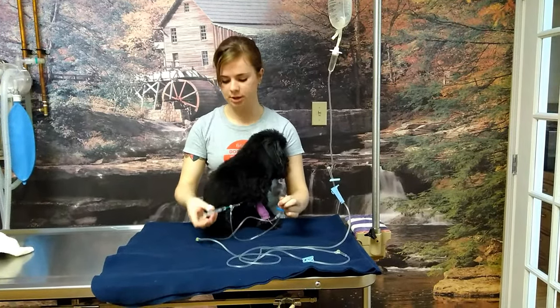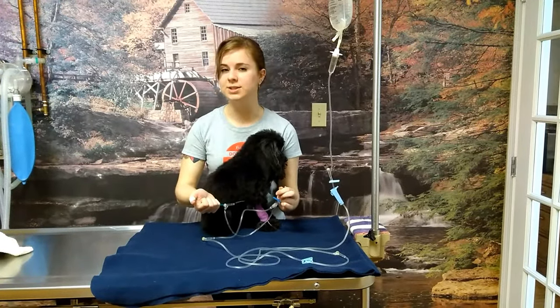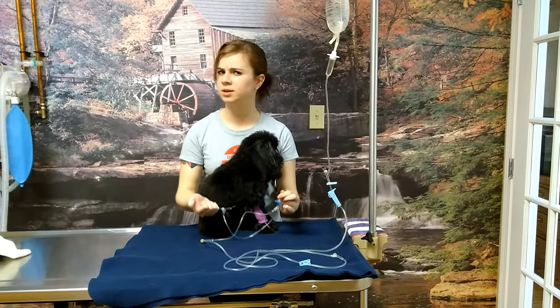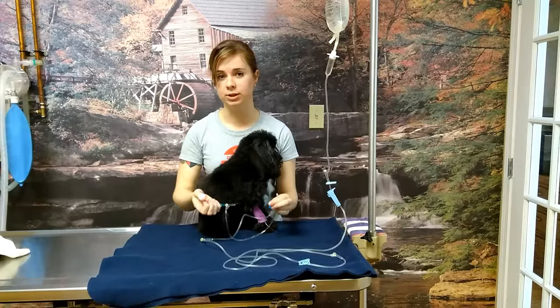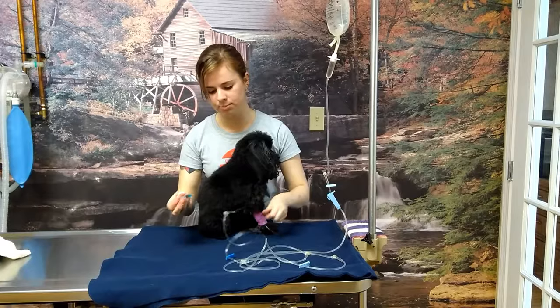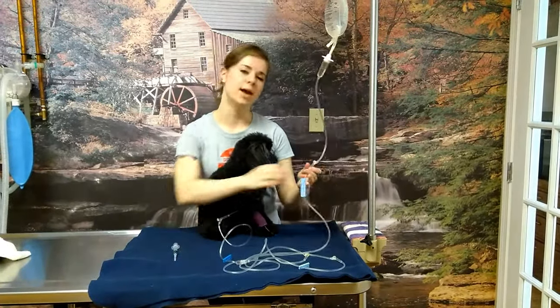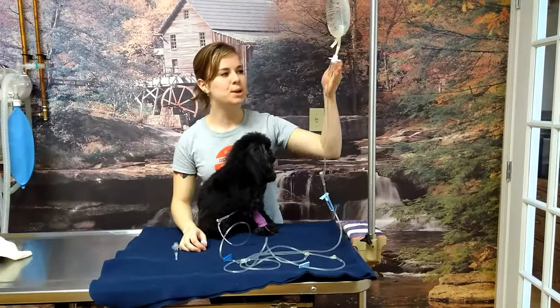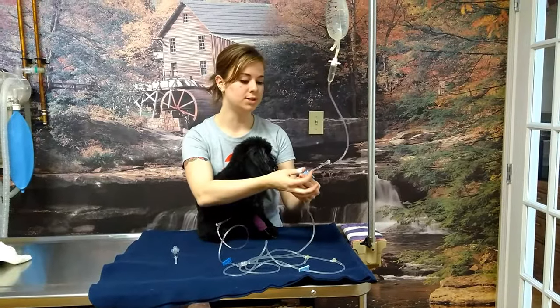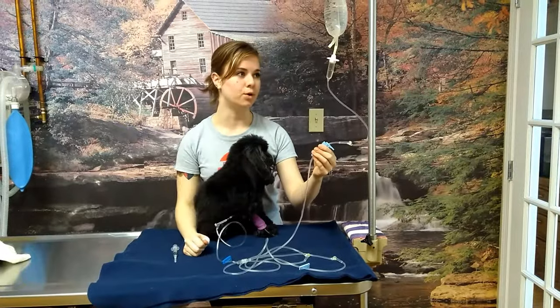Pinch closer to the bag than to your pet, and slowly pump in the fluid in short but strong bursts — that will hopefully push the clot through and out. You might initially feel some resistance, and that is you fighting the clot. But if all of a sudden it gets a lot easier, there's a good chance you've released the clot. Release your pinch, pull out your needle, and check your drip rate again. We do have a drip again, so make sure to readjust your drip rate to the prescribed amount going into your pet.